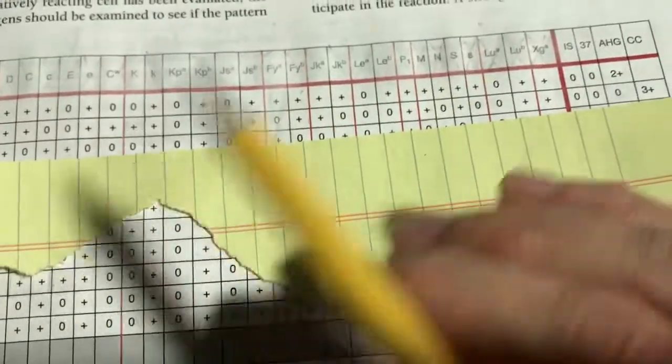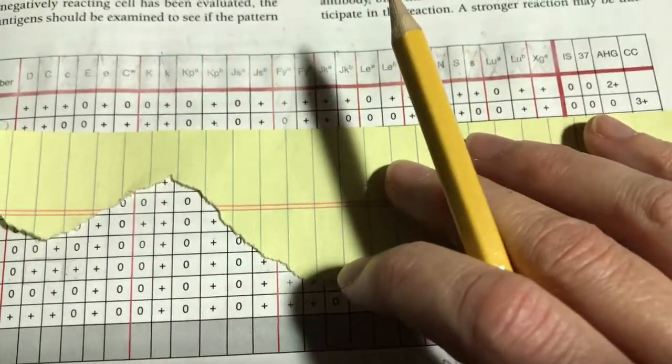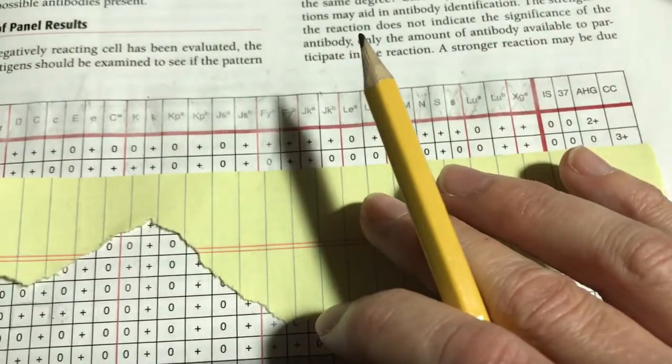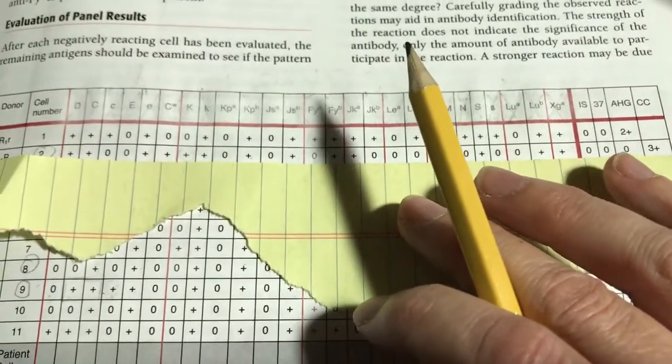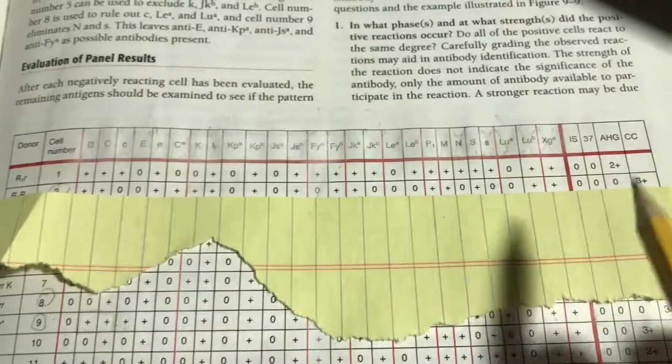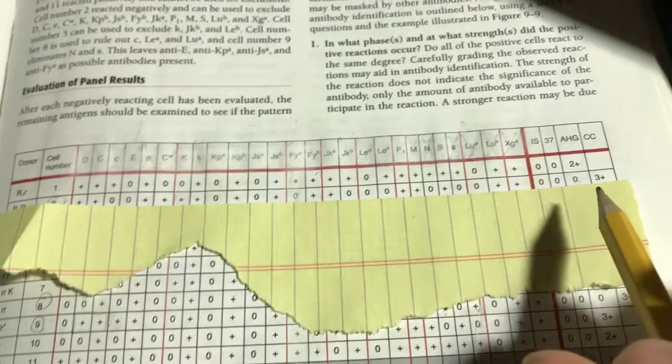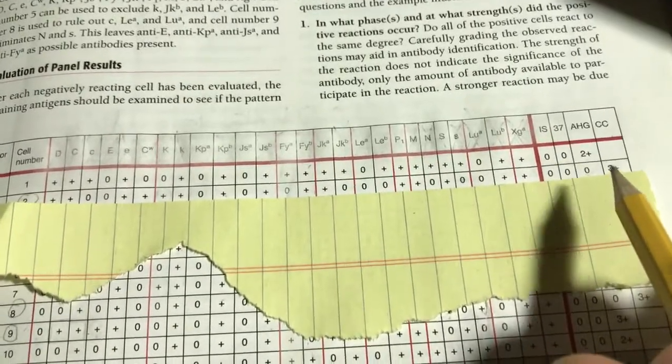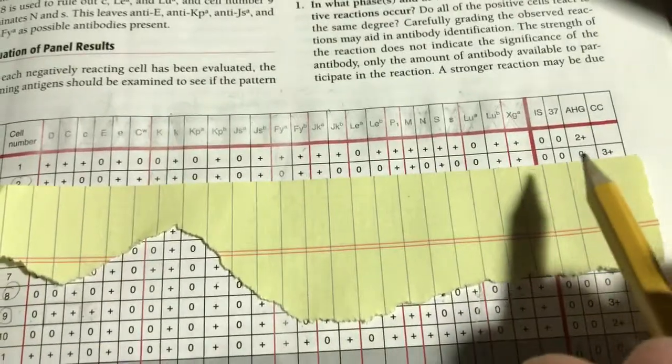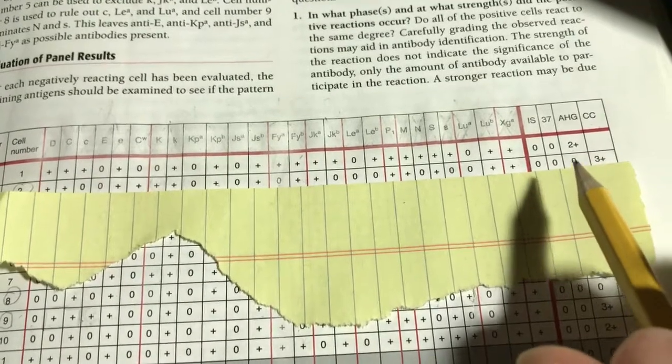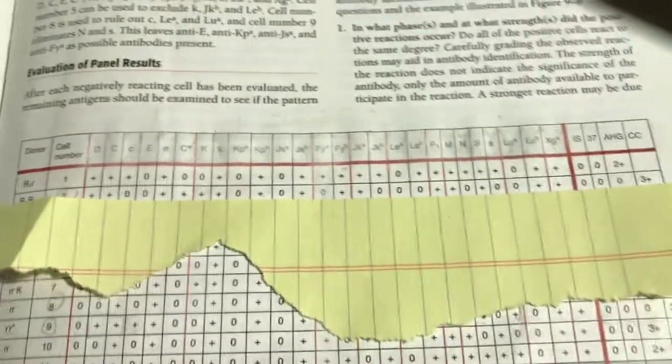I included gel here because they do occasionally exhibit dosage, the antibodies. Keep that in mind as you're ruling out antibodies. With a negative reacting cell, you either need two reactions that are negative with heterozygously expressed cells or one time with a homozygously expressed cell because it's strongest, it's weakest if it's heterozygously expressed.